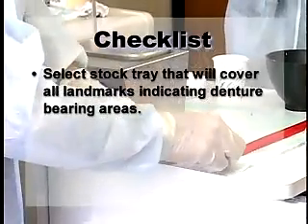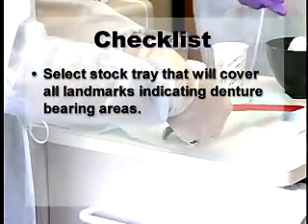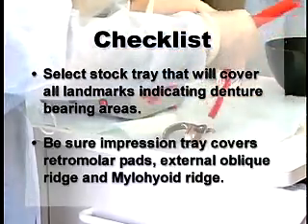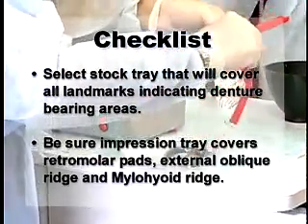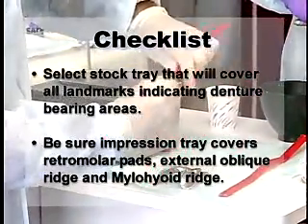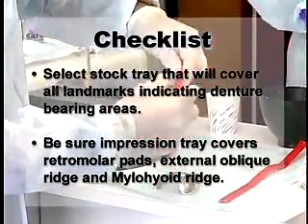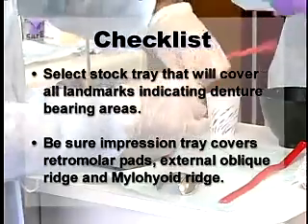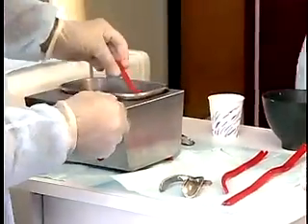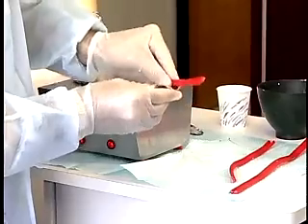Select the stock tray that will cover all landmarks indicating the denture bearing areas. Check the impression tray and make sure it covers the retromolar pad, external oblique ridge, and mylohyoid ridge. Any deficient area should be corrected by utility wax.